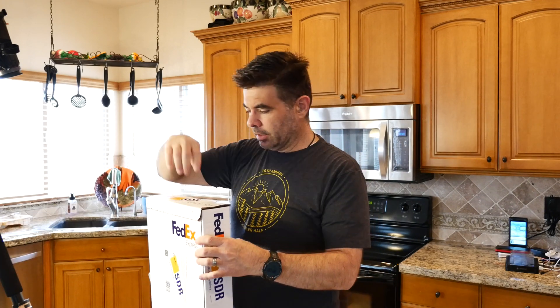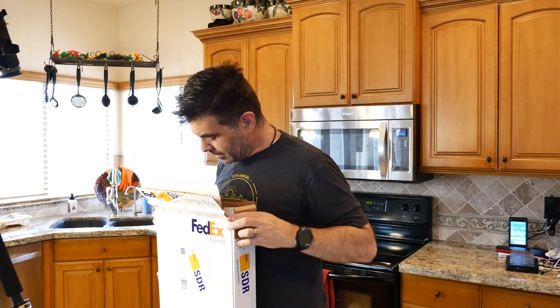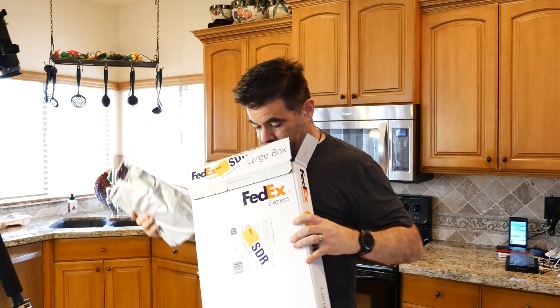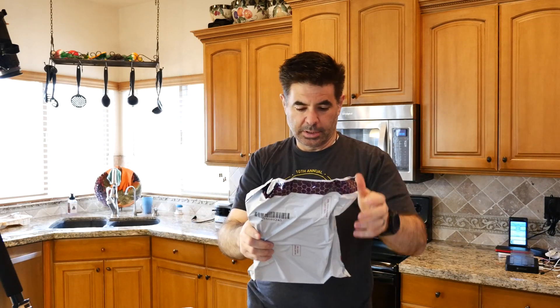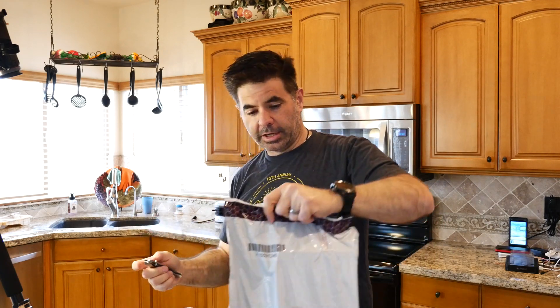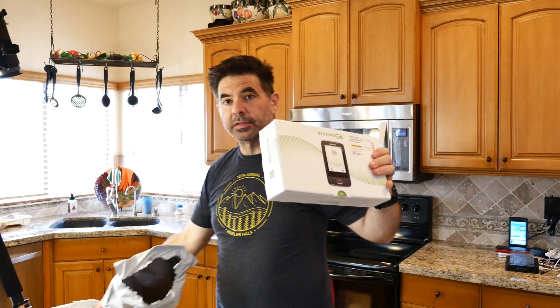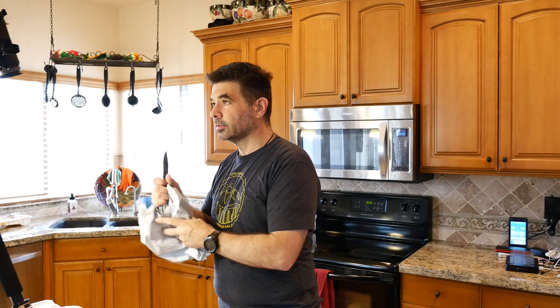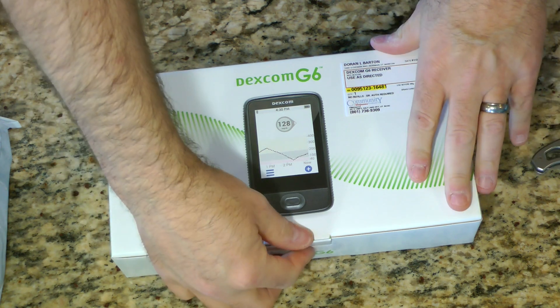Let's start out with the Dexcom. Here it is. We'll see what's in each of those bags. We'll just cut these open with our handy dandy pocket knife. All right, so this is the Dexcom receiver. Should we open it up? Let's open it up and see what's inside.